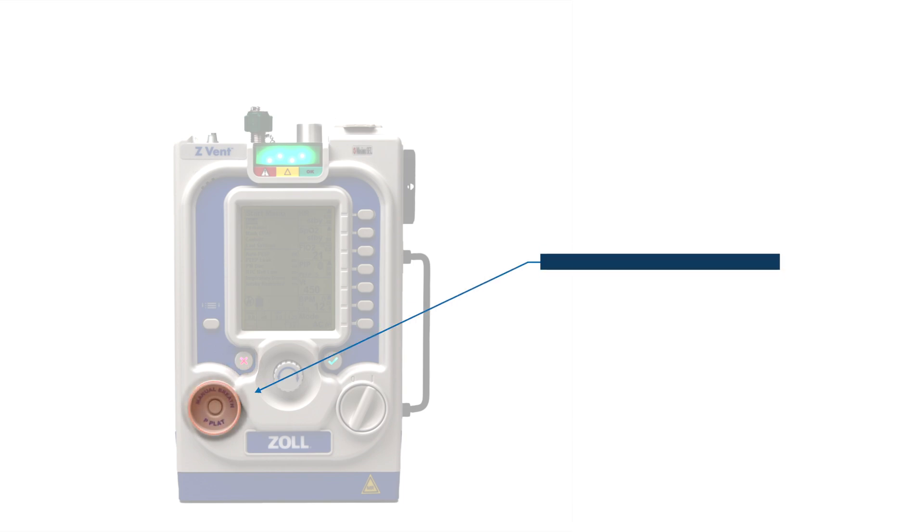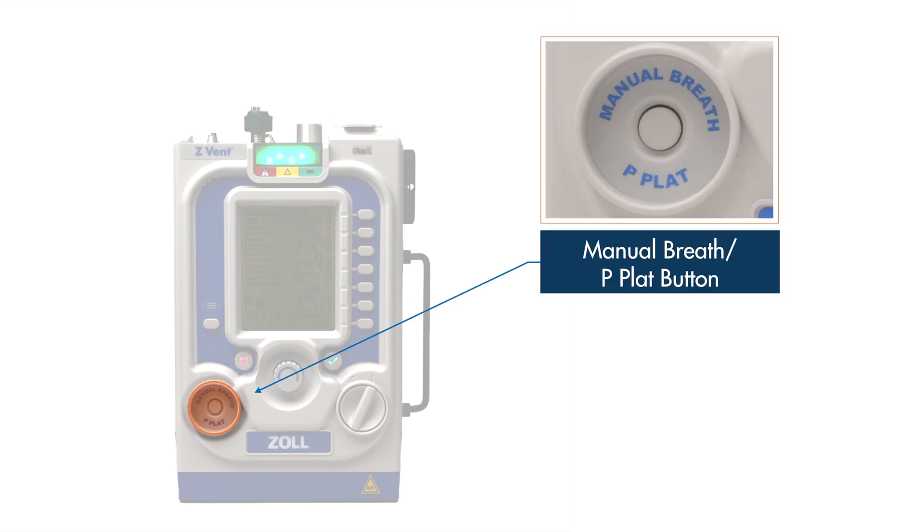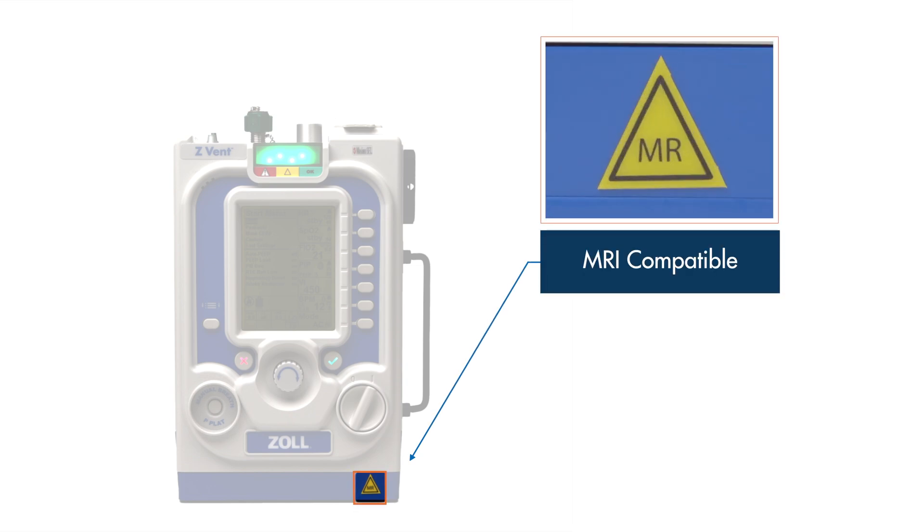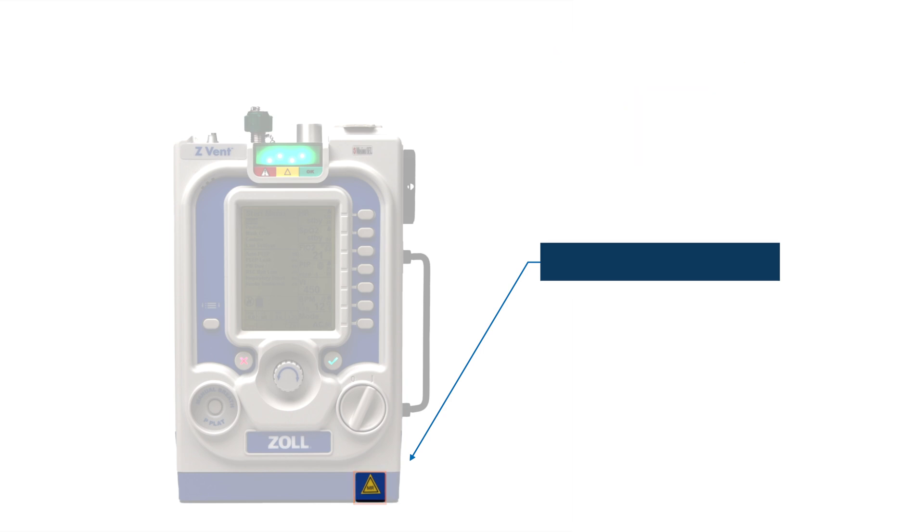In the lower left corner is the manual breath button. This button enables the user to deliver a single manual breath to the patient. If the ventilator supports the plateau pressure option, this button will also be labeled P-Plat. The user may press and hold this button to perform a plateau pressure maneuver. Along the bottom of the front panel is the yellow MR triangle, which indicates that this device is equipped and approved for MRI compatible use.